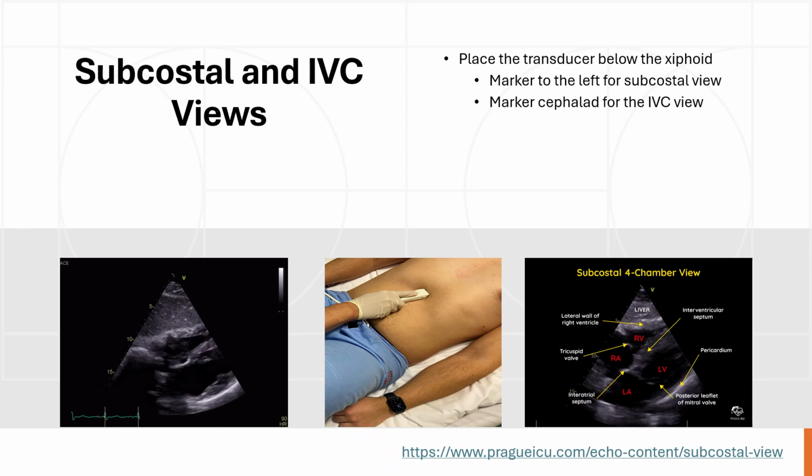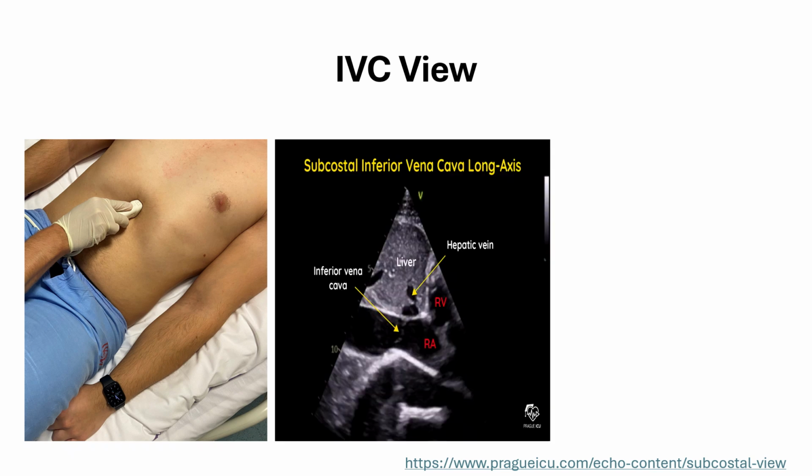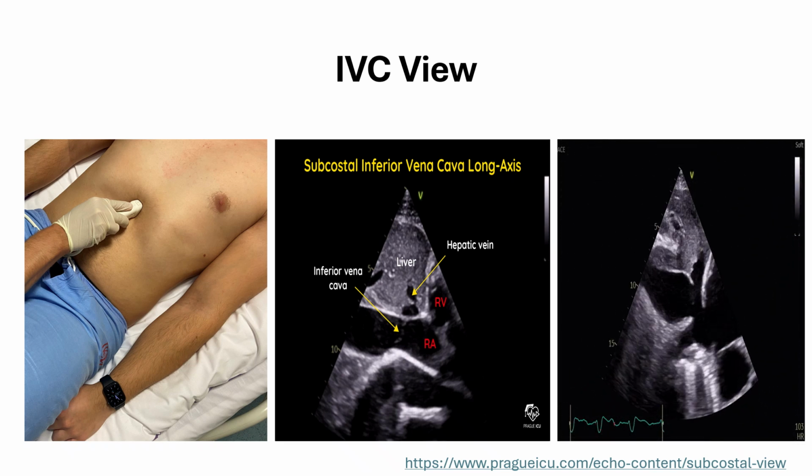And on the picture, or actually a movie on the left, you see a live image of a subcostal view. Let's take a moment to review the slide. Next, let's take a look at the IVC views. Again, the marker of the probe is pointed cephalad. Here's a typical anatomy of the view, and here you see a live image.